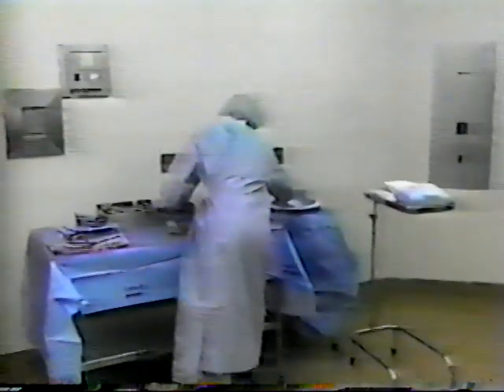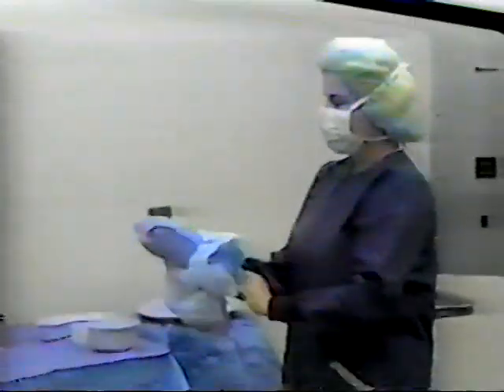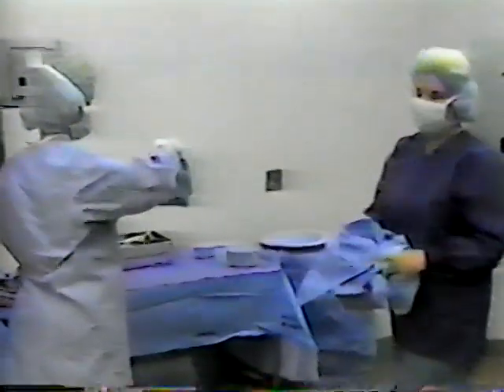When opening small packages, open the far side first and the near side last. Secure the wrapper tails so they will not spring back and contaminate the sterile item. Extend the contents toward the sterile person so he or she can lift it away from the package cleanly without touching the wrapper sides.